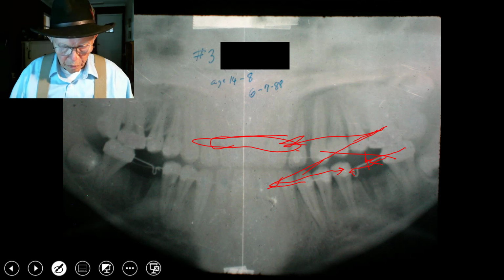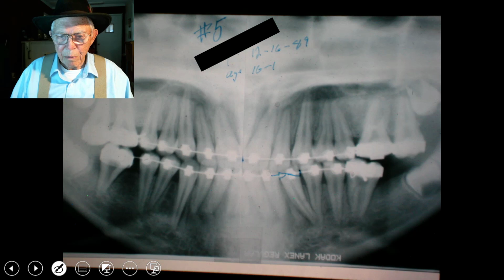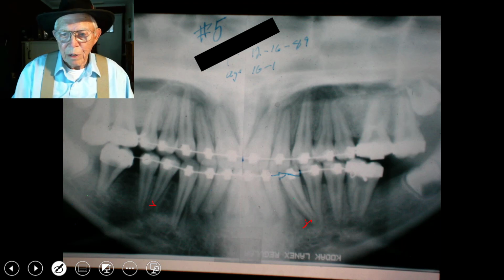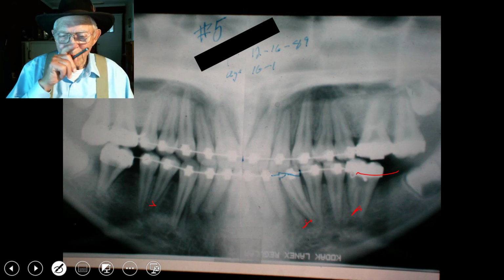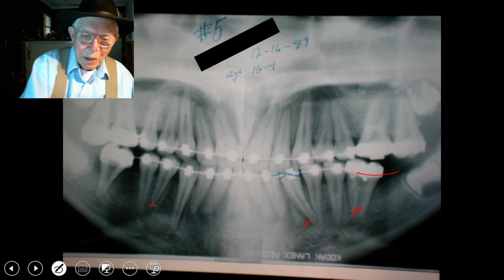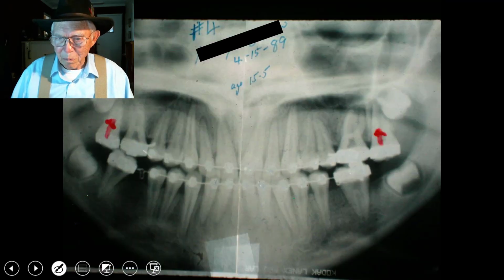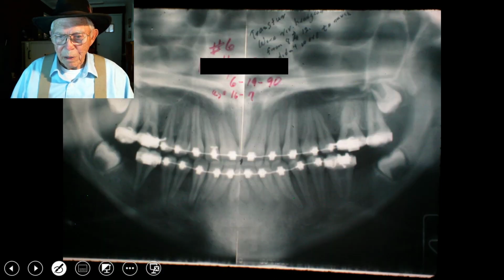Now, here we'll go here. So we band that upper second molar, hold it up while we close this gap, and we'll pull that all the way together. Now we got this tooth right here we need to straighten out, and also this one right here we don't like. We've got the molar root further forward than I actually want it to be. If you went back and looked at this, it was that way, and now we've got it a little over-corrected, and we'll have to correct another bicuspid deal in there also.